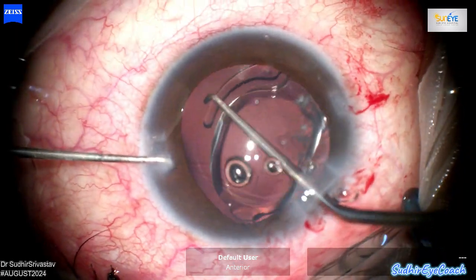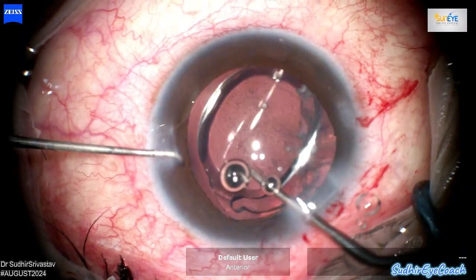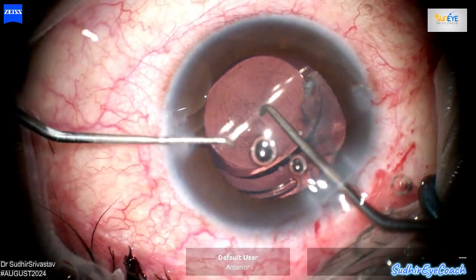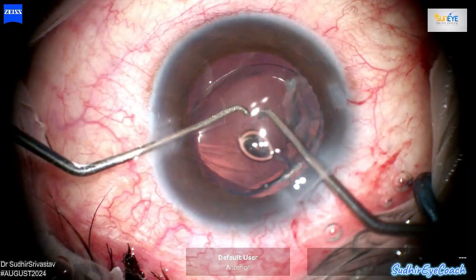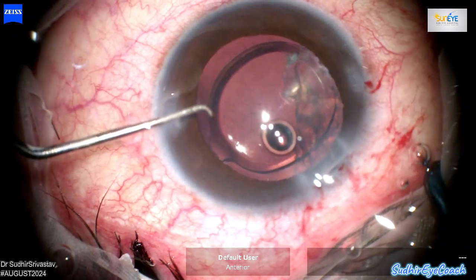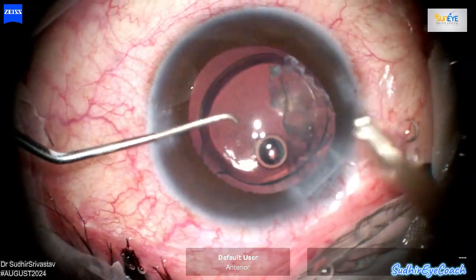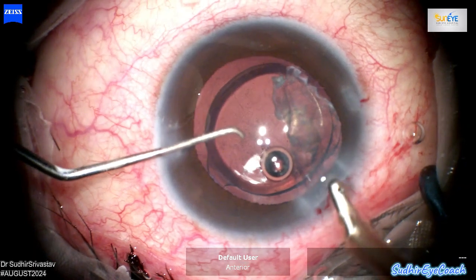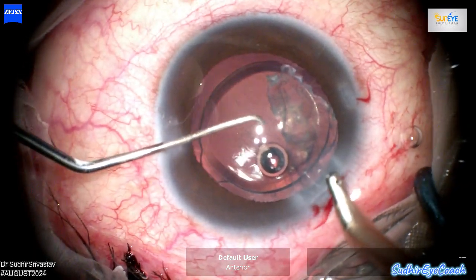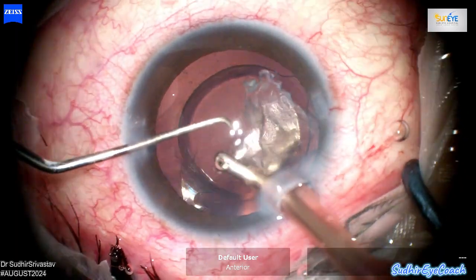Next I used a Sinskey hook to reposition the lens into the capsular bag. With very gentle maneuvers, I repositioned the lens in the bag and ensured both haptics were properly seated in the capsule. I then tapped the IOL haptics to encourage the remaining cortical matter to move anterior to the lens. This allowed me to use the lens as a scaffold to easily remove any residual cortical matter.